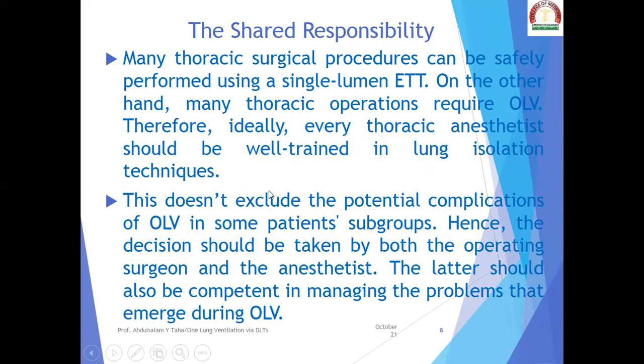This doesn't exclude the potential complications of one lung ventilation in some patients' subgroups. Hence, the decision should be taken by both the operating surgeon and the anesthetist. The latter should also be competent in managing the problems that emerge during one lung ventilation.